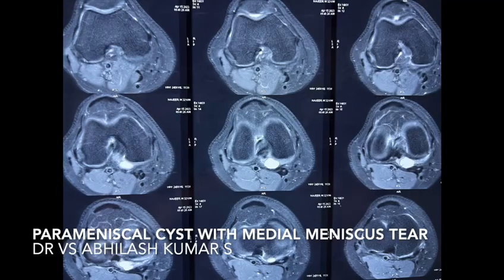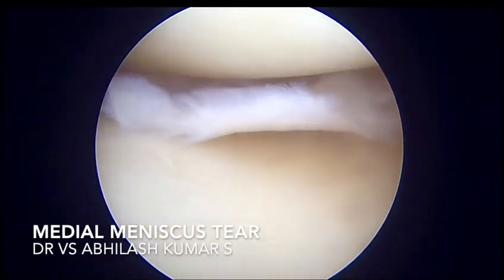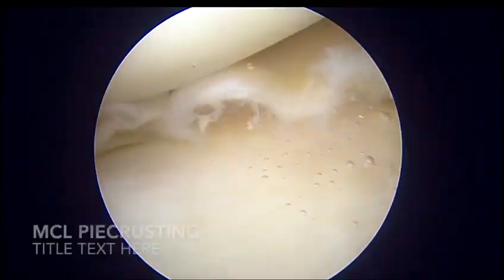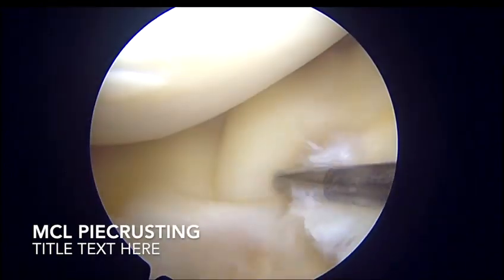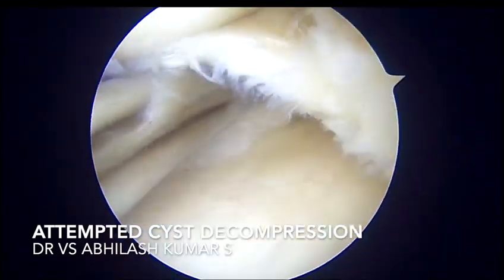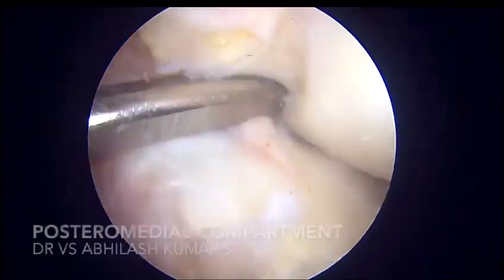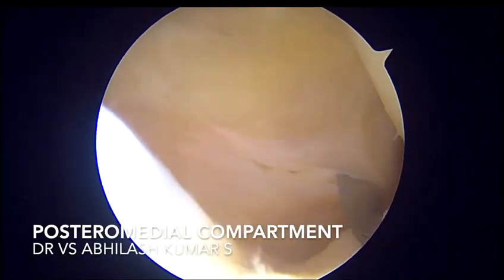The 30-year-old gentleman presented with a medial meniscus tear and a parameniscal cyst. On arthroscopy, the flap tear in the medial meniscus is excised. MCL pie-crusting is done to open up the medial compartment. Decompression of the cyst is attempted anteriorly, as it could not be decompressed completely.